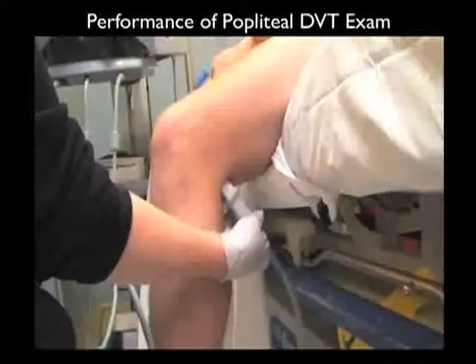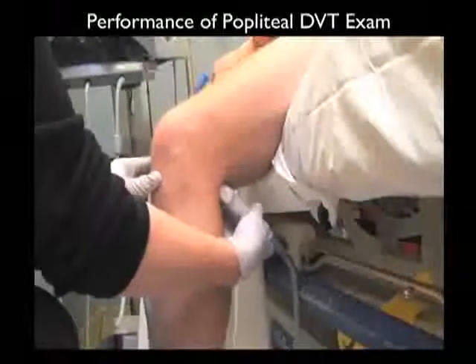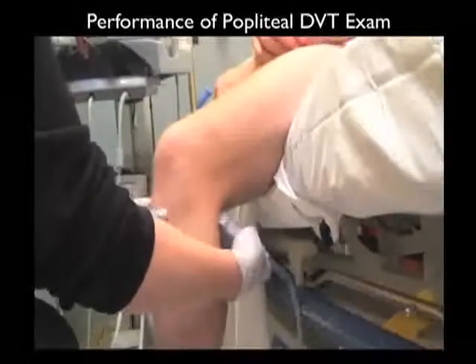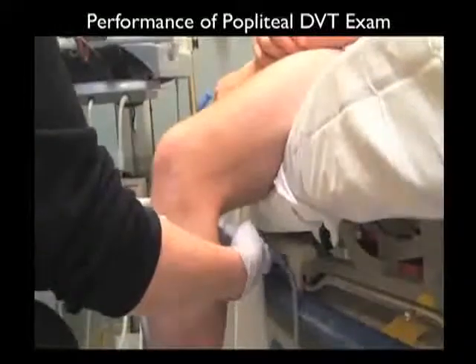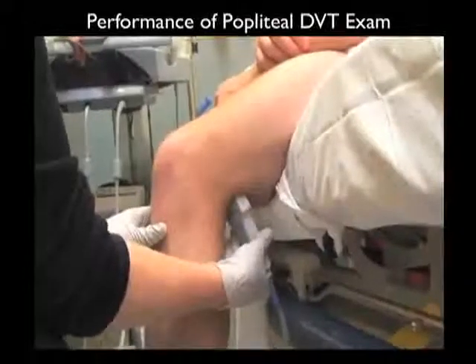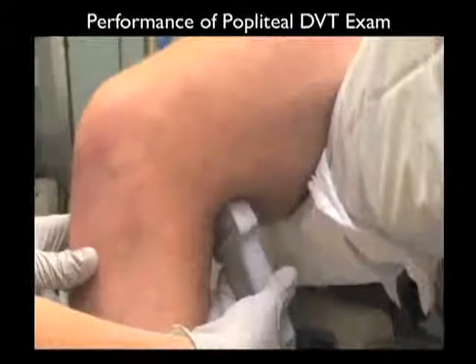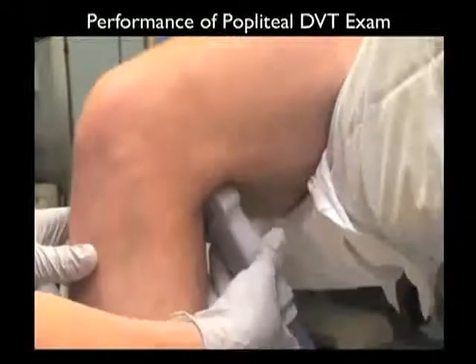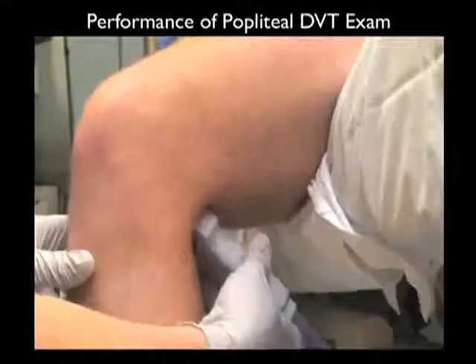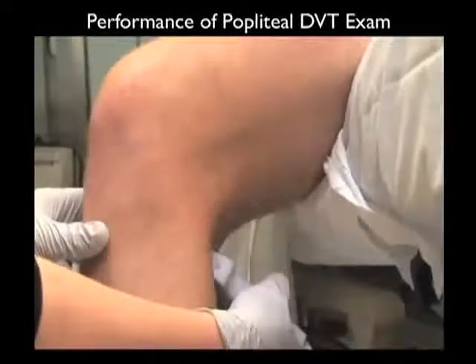It's best to have the patient sitting up to further distend the popliteal vein, and I like to have the patient sitting up with the leg dangling over the bed. I can then pull up a chair and move anterior to the patient. We'll place the high-frequency linear array probe high within the popliteal fossa, sequentially compressing it levels down all the way down to trifurcation. Notice that we're using our other hand to stabilize the anterior knee as we press with the probe posteriorly. So again, we'll start high within that popliteal fossa, compressing sequentially all the way through the levels of the popliteal artery and vein, down inferior there, all the way down to trifurcation.